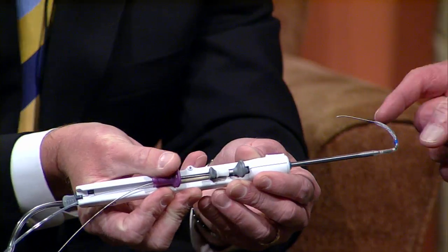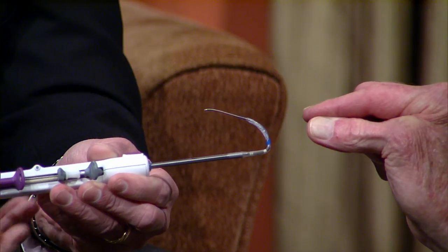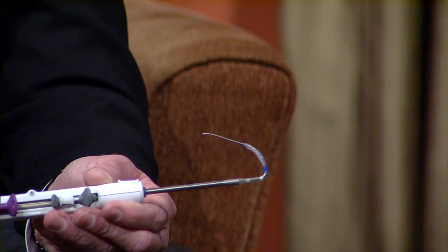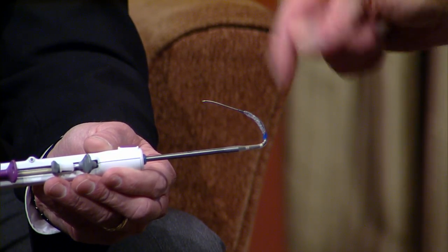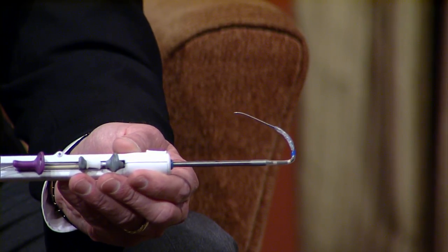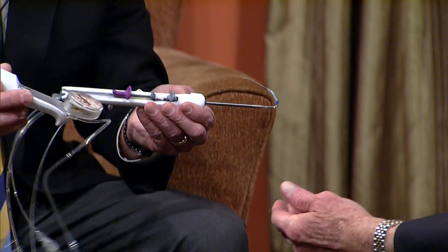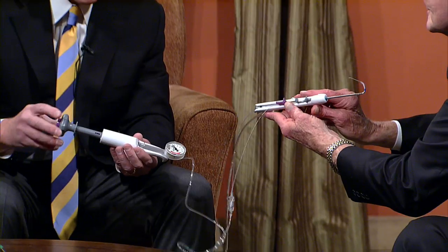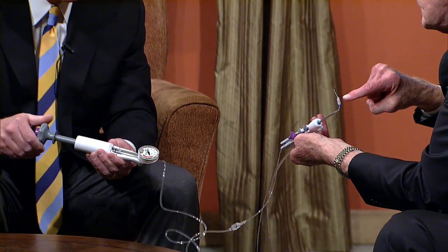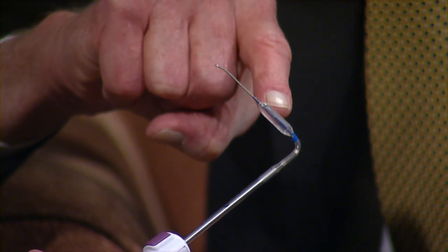So this is going to be the balloon right here? That's correct. It's deflated right now. You're in the sinus, you've found the sinus passageway and the opening, and then you inflate the balloon with this device — this is what your assistant does. You simply inflate the balloon, and you can see the balloon inflating right now. It inflates to what we know is the appropriate pressure to remodel the sinus.